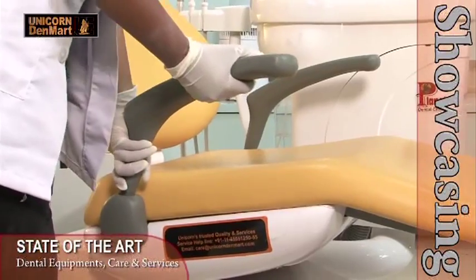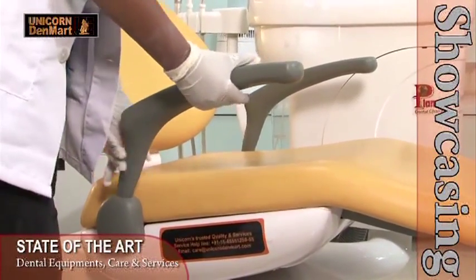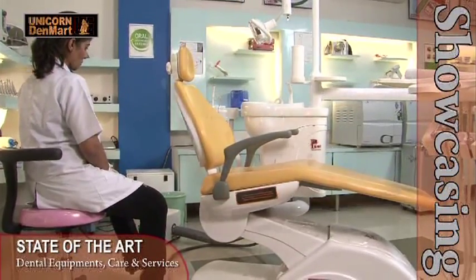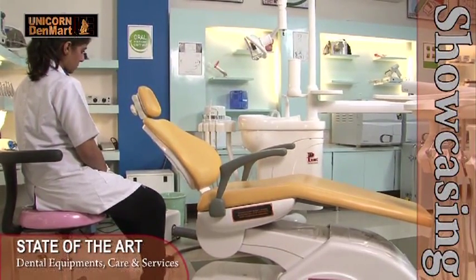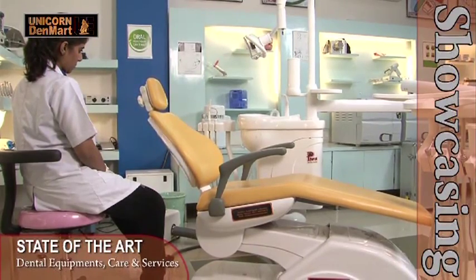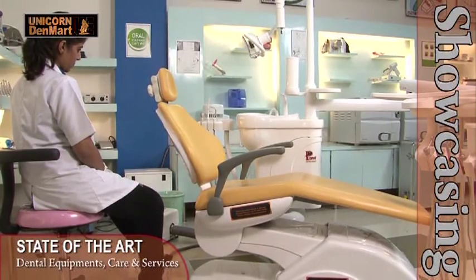With a rotatable armrest, Planet allows the patient to easily seat on and off the chair. The independent up and down movement along with back and forth movements allow the chair to be flexible in various portions of dental treatments. With an intelligent system, the chair returns back to zero position at the end of the dental procedures.